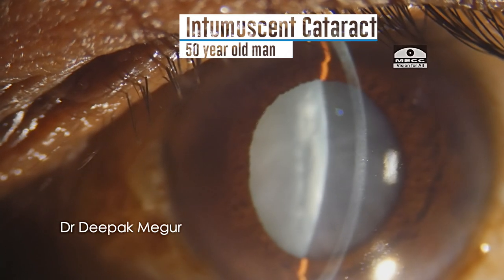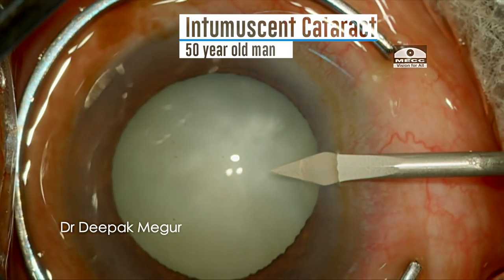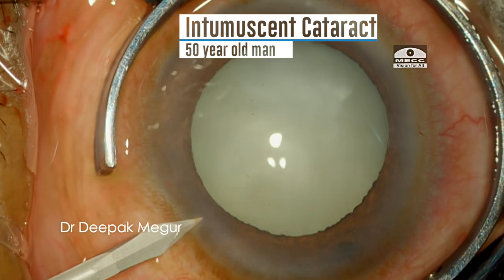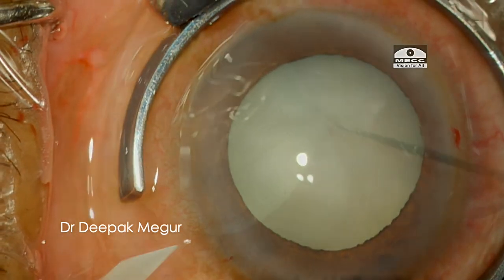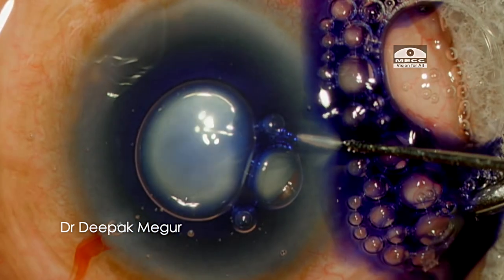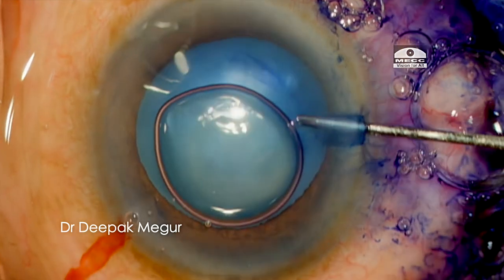This is a 50-year-old man with an intumescent cataract — a challenging case no doubt. The lens is swollen, but critically there do not seem to be any subcapsular pockets of fluid cortex, which we commonly see in other intumescent cataracts. The cortex is more jelly-like and I don't expect fluid to come out when we puncture. Anyway, let's see how things pan out.